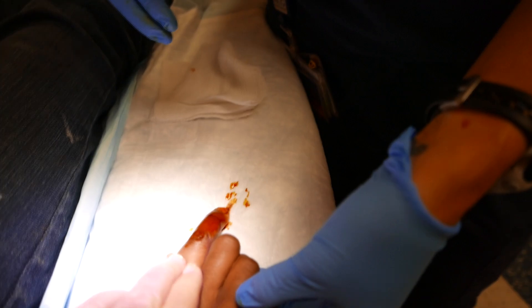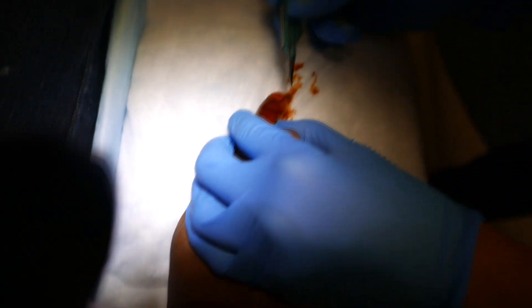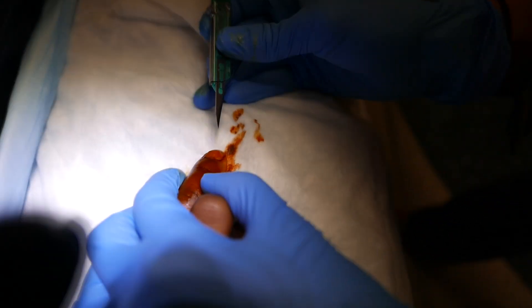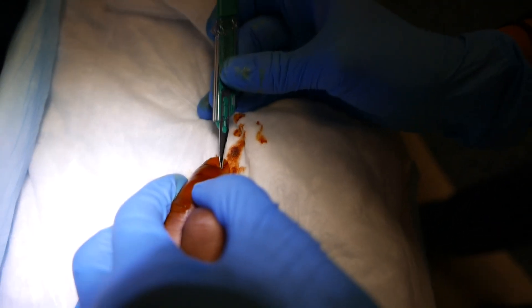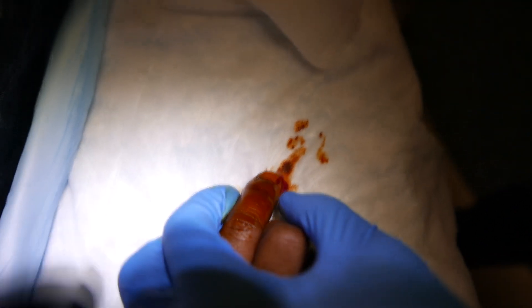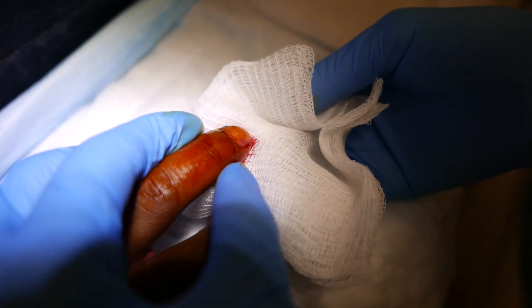Put your head back, sweetheart, and just kinda look over at the wall, okay? You're not gonna feel this. I'm gonna get in your way, girl. You ready? Don't jerk your hand, okay? Are you ready? Play it flat, though. I bet you guys don't know that she already got cut. You felt me — I know you didn't.